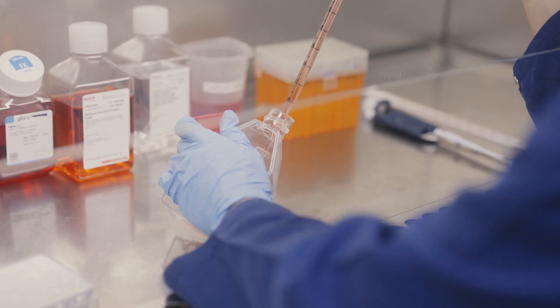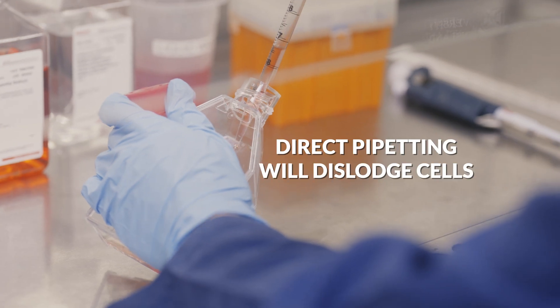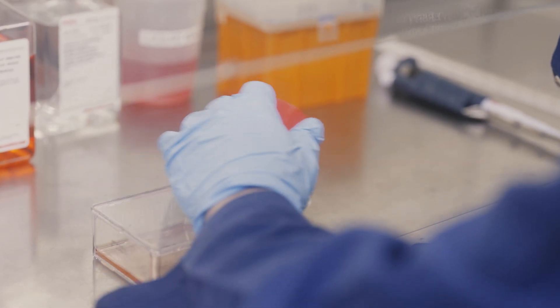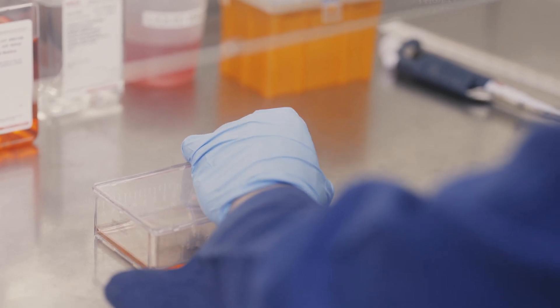The last mistake is the lack of finesse in adding the new media to the flask. The cells are most likely to adhere to the bottom of the flask, so any liquid that is added to them that is not designed to mechanically dislodge them should be gently prepared down the side of the flask to minimize disturbance. In this case, all we're doing is a simple change of nutrient media to allow the cells to continue growing, so the gentler the better.